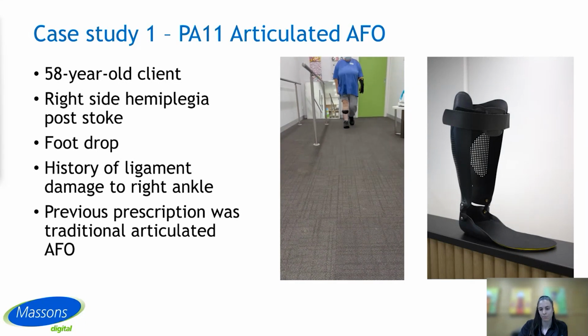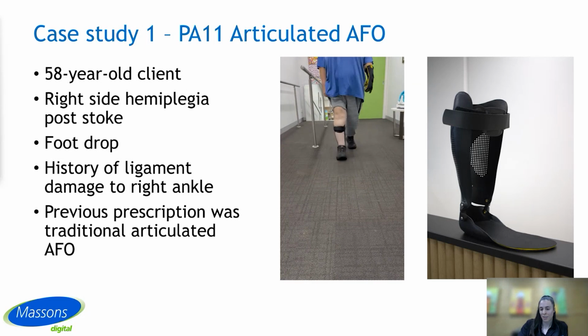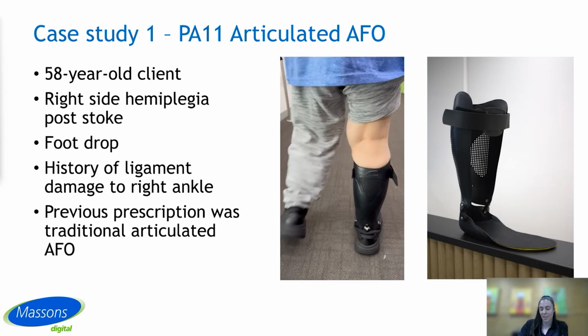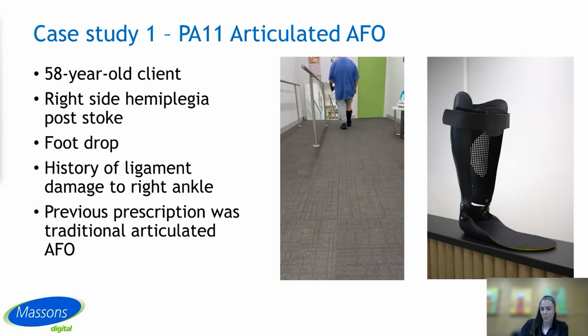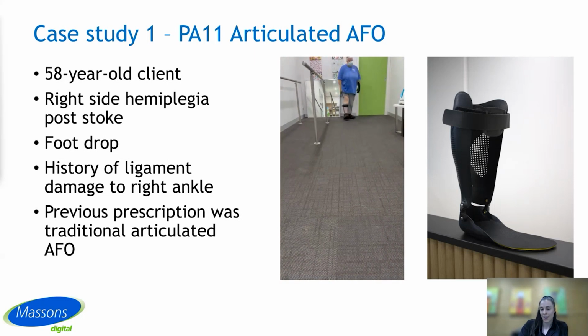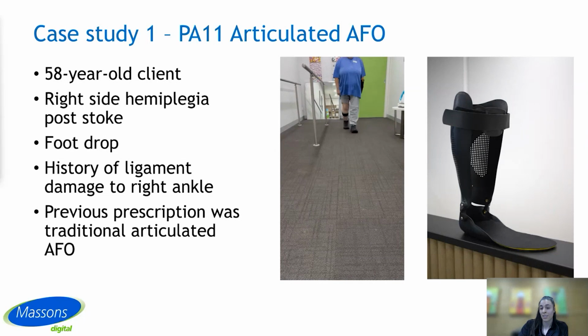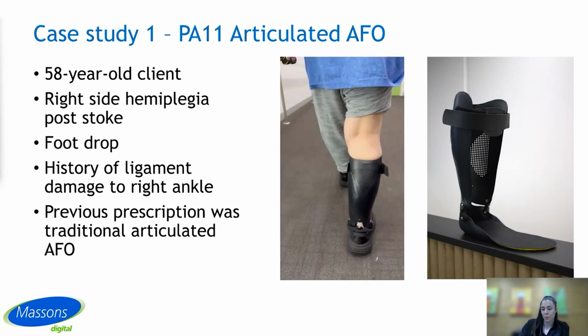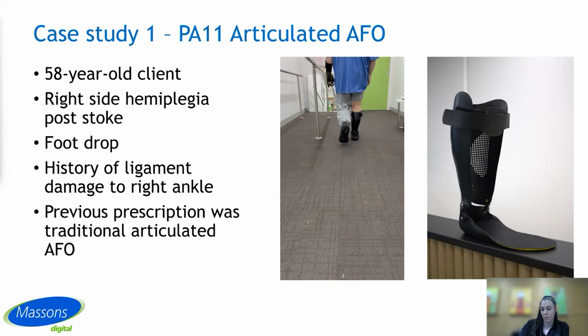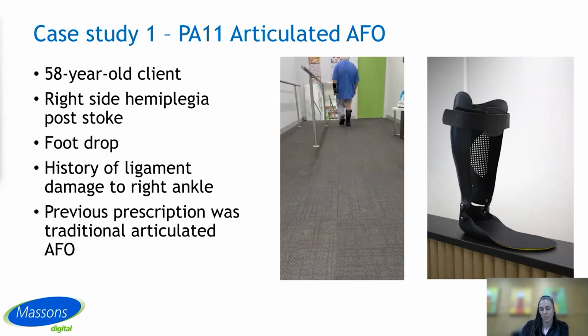So I'm in a very fortunate position where I have an expert digital manufacturing team here with us. So leaning on their expertise, we designed an AFO, actually the exact AFO in the image above, with the goal of giving the client all the support that her traditionally made AFO was providing, but improve the weight and the breathability.